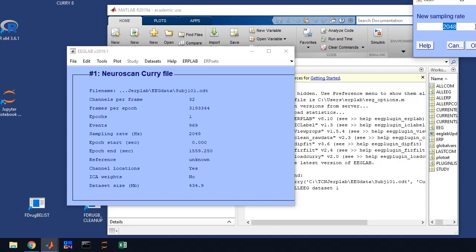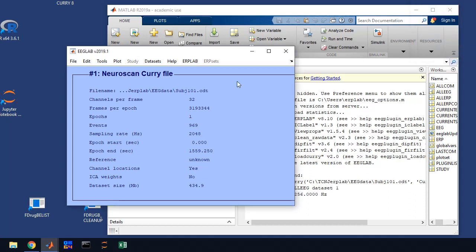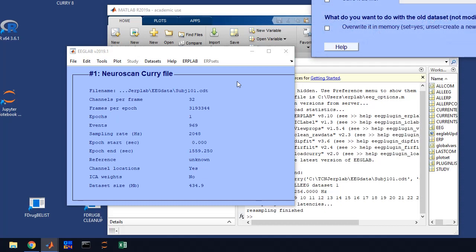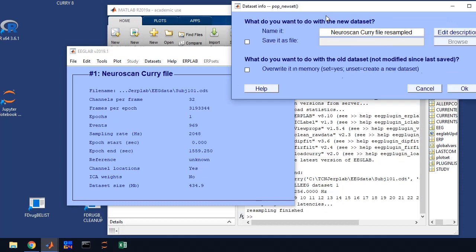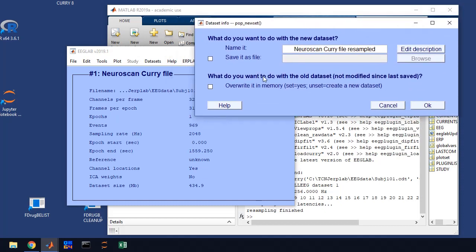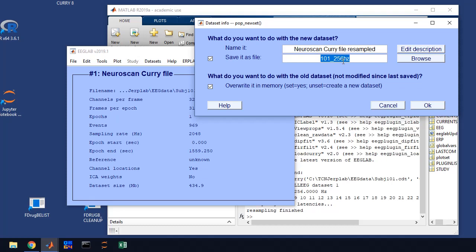We're going to change it to 256. I'm toying with the idea of changing it to 250 so in the future you might put 250 in this box. But for right now use 256 and click OK. You're going to get a save window. You're going to save it by subject number 101 and then an underscore and then what we did, so it's 256 Hertz downsampling.